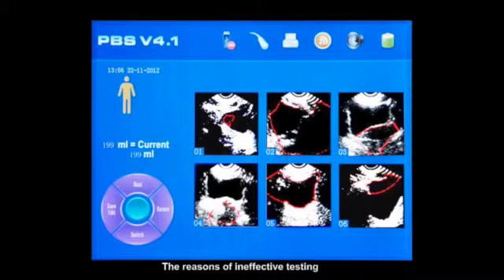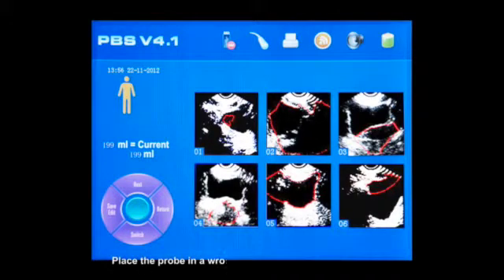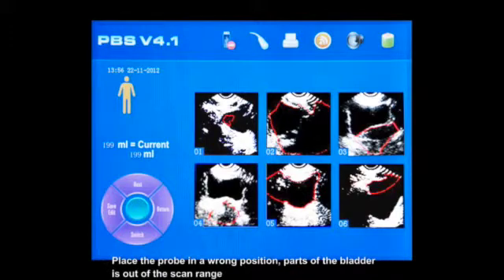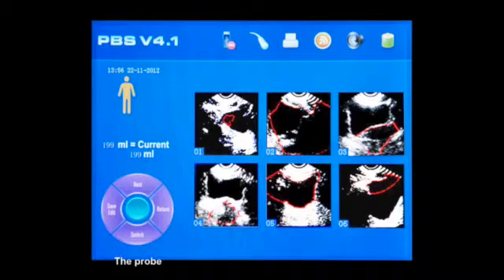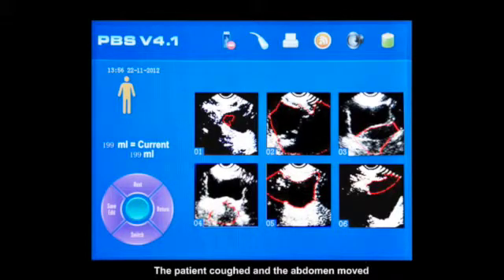There are a number of reasons you may get an ineffective testing result. If you do not use enough gel, the bladder edge may not be clear. If you place the probe in the wrong position, parts of the bladder are out of the scan range. The probe has been moved or shaken, or the pressure of the probe is not enough when scanning. Maybe the patient coughed and the abdomen moved.